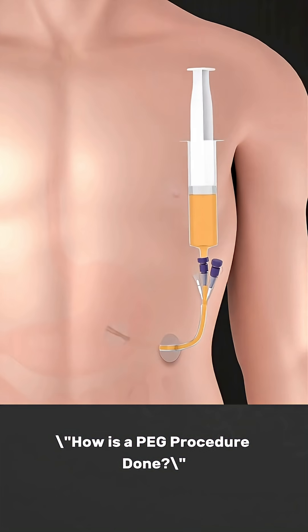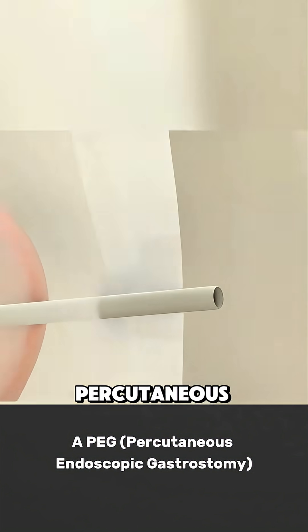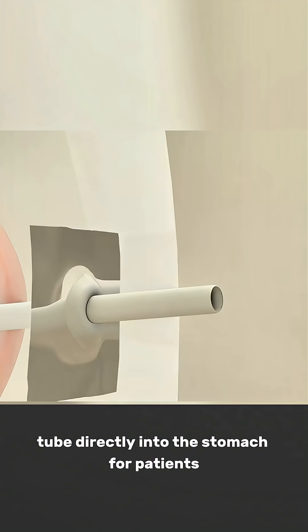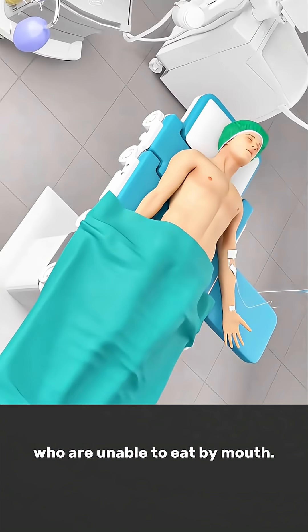How is a PEG procedure done? A PEG, percutaneous endoscopic gastrostomy, is a medical procedure used to insert a feeding tube directly into the stomach for patients who are unable to eat by mouth.